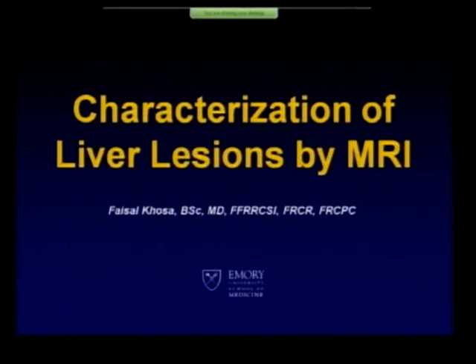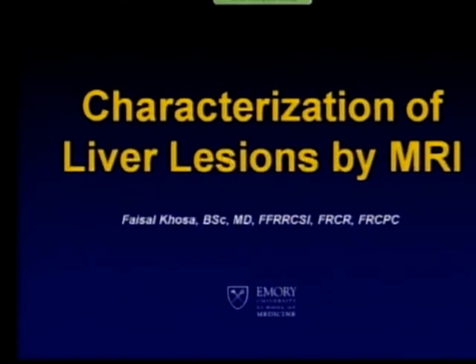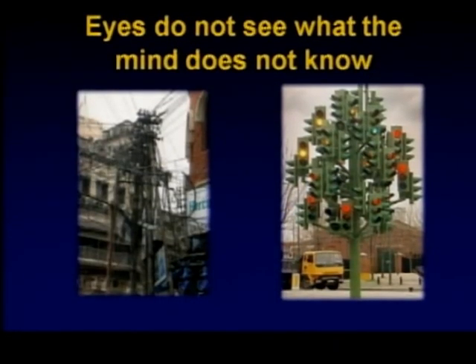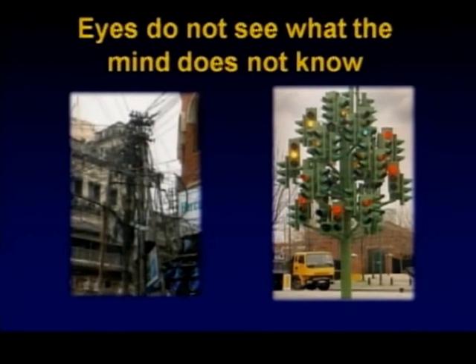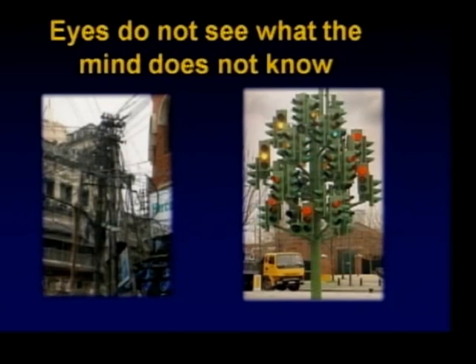Thanks, Dr. Stillman. The topic today is characterization of liver lesions by MRI. I have no financial disclosures, and of course, I'm a radiologist. I have no money. Eyes do not see what the mind does not know.